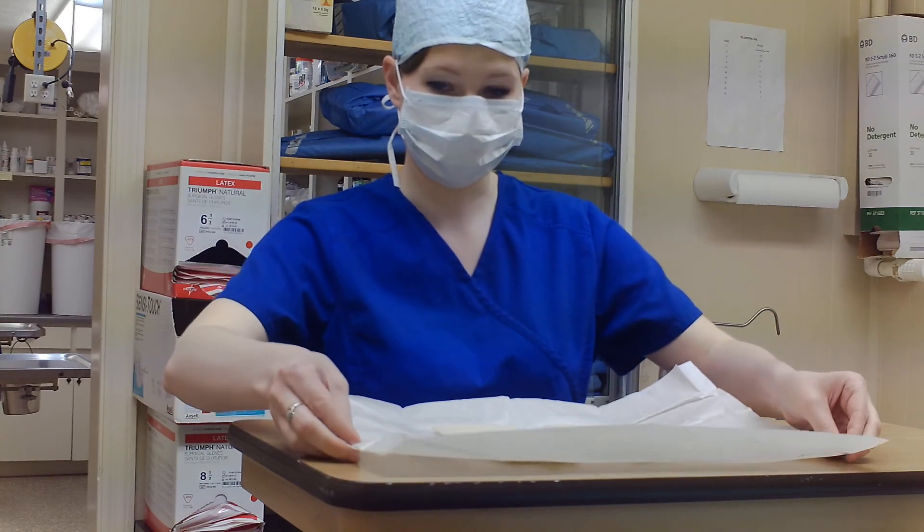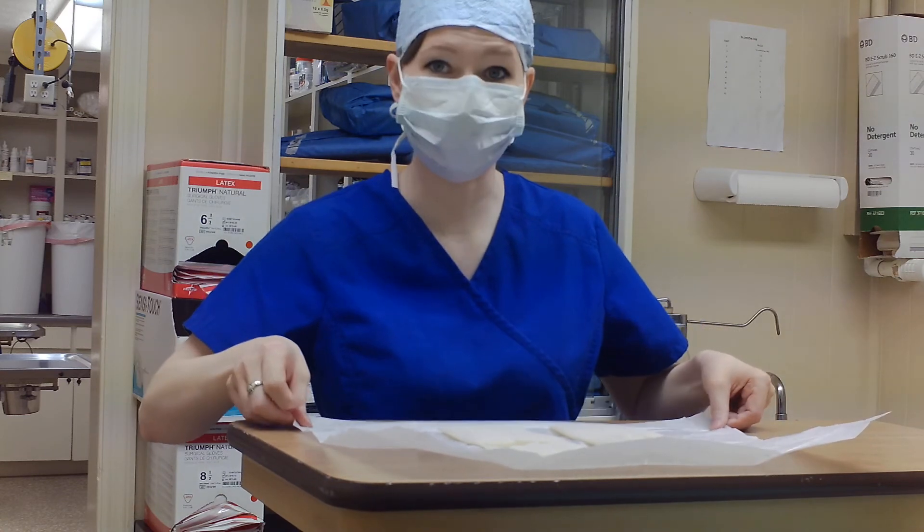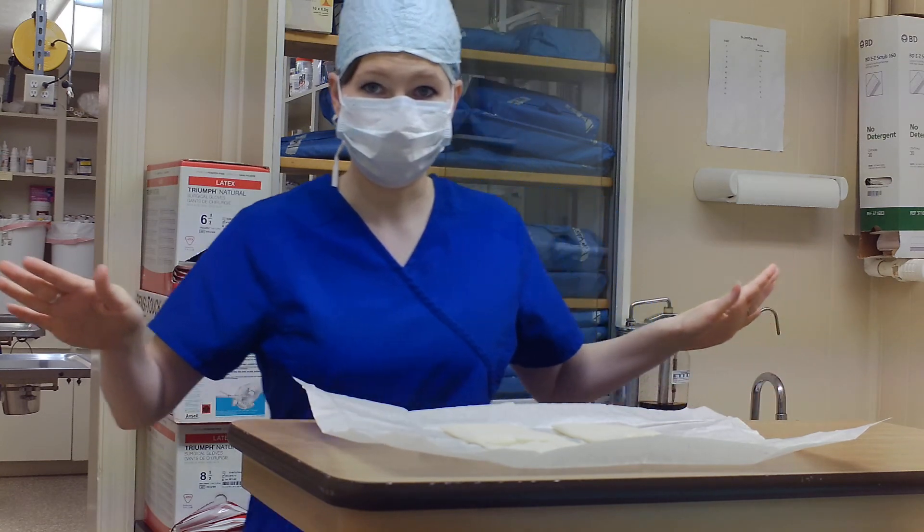Once you get it opened, do not let it fold back in on itself. Because once it folds back in on itself, the gloves are no longer sterile. Once you open it, that's it — keep it open. Back away. The sterile personnel can go in and glove in. And that's it.